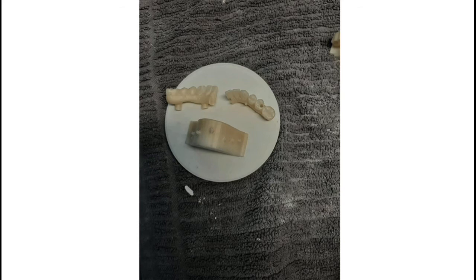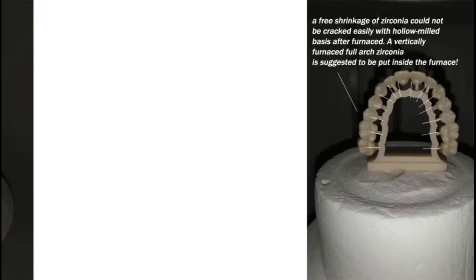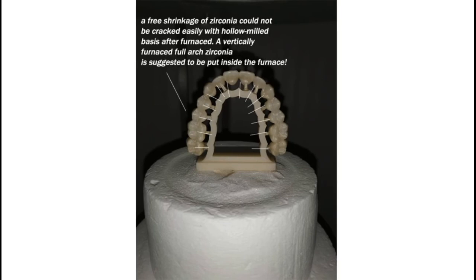Tip 4: Zirconia-specific grinding tools are recommended after the full-arch is furnished. No metal-related tools should be applied. Use a grinding manual machine at 25,000 RPM. Some micro cracks can be fixed and polished by sandblasting at 2.25 bar (0.20–0.25 MPa) using 50-micron (270 mesh) high-purity alumina sand.